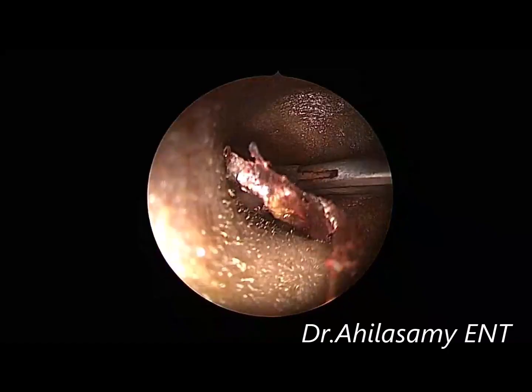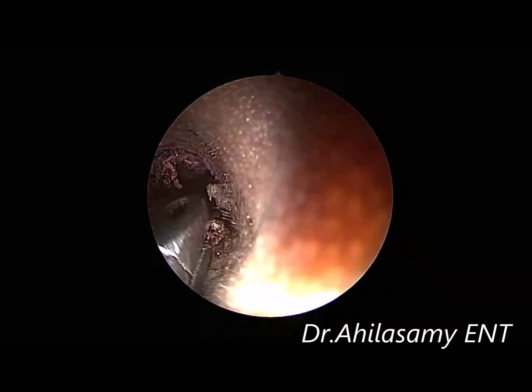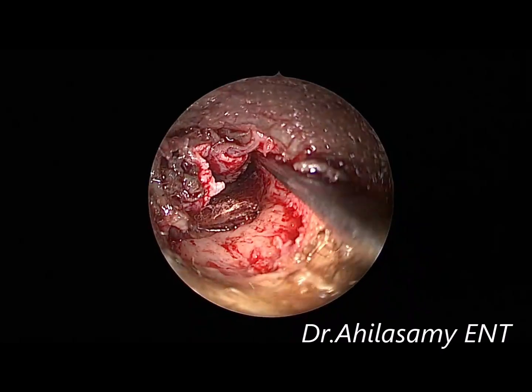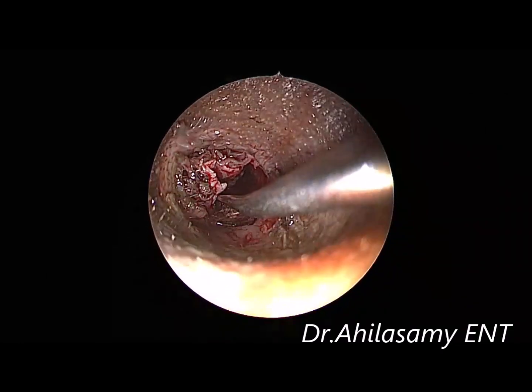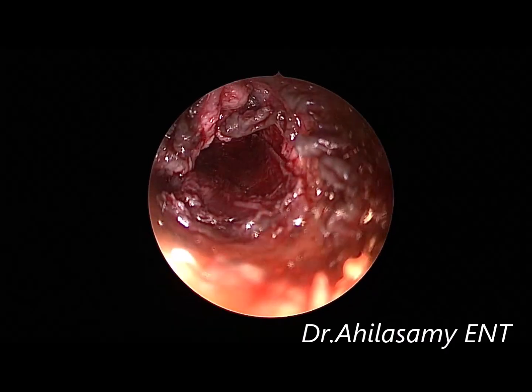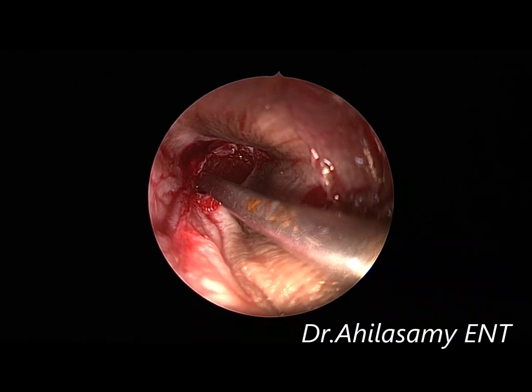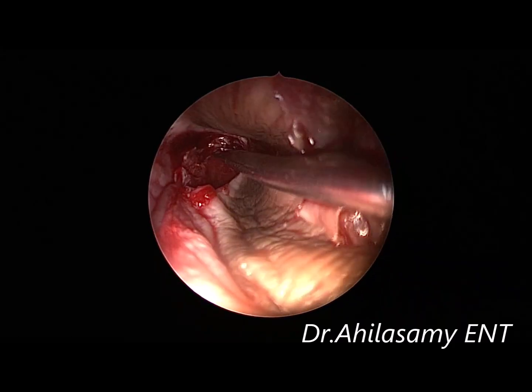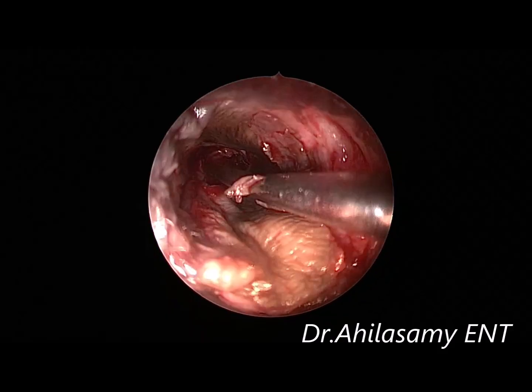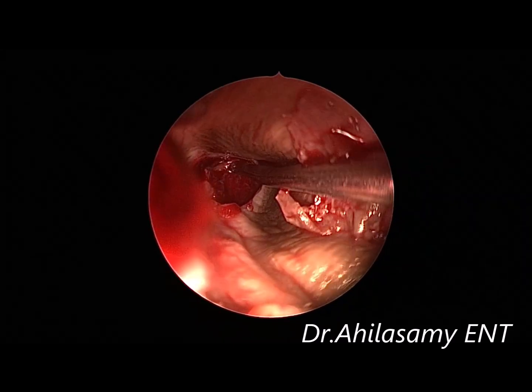Now I am using the dried temporalis fascia graft harvested from the same patient's temporal region. I am using the skin elevator to push the graft anteriorly up to the anterior annulus, then put back the flap. See the approximation and tuck in the anterior margin of the graft very well so that it completely covers the perforation area. It is almost very well and completely covered.